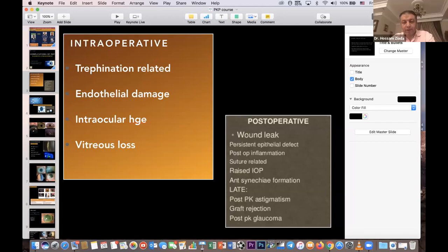Okay, but you think that the situation is always suitable for doing rexis? Not always, of course, not always. As much as I can. Okay, I know. But if you find that the rexis will take time, you will go for the capsulotomy and removal of the whole nucleus. You will implant the IOL at once, after clearing the cortical materials, right? Yeah, but I try to do it into the bag, inside the bag.